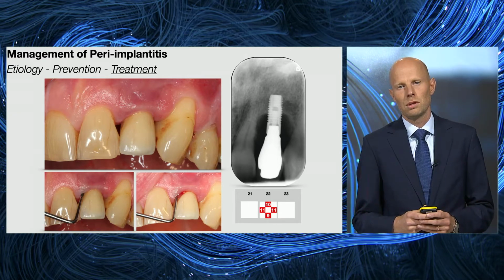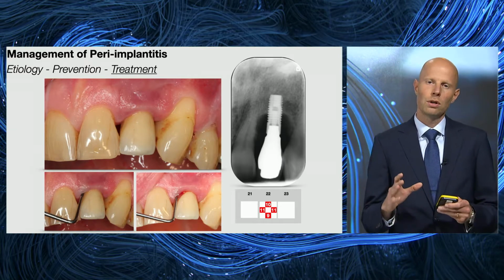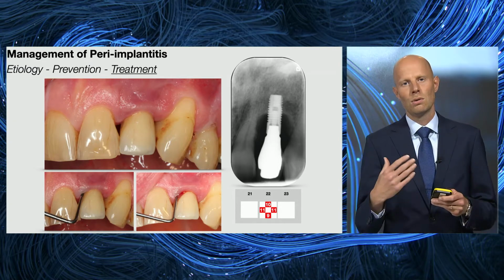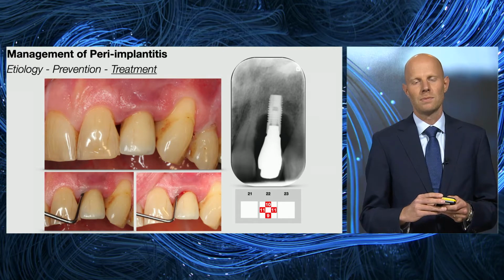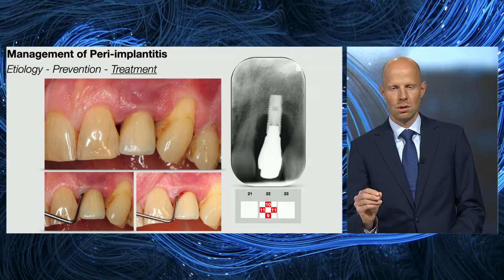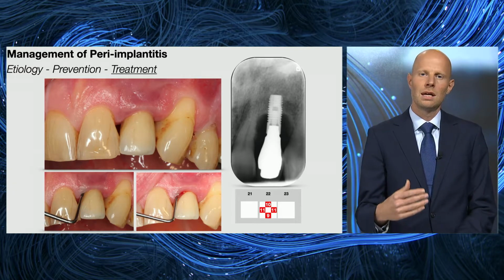It is peri-implantitis. Now in these couple of minutes, I will focus on the advanced case of peri-implantitis. I will not talk about mucositis or the early incipient forms. These are established cases. And our understanding is that non-surgical approaches are rarely sufficient to treat the disease in its entirety.